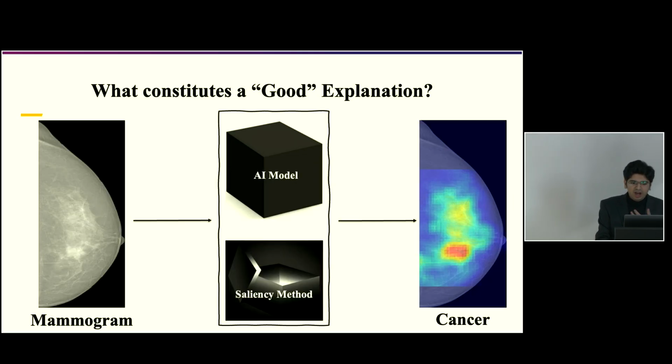So, how do these really work? Essentially, like in our case, we would have a mammogram. We would have an AI algorithm that made a prediction on cancer or not, just a simple binary prediction. And then there will be a saliency method that wraps on top of it, which ingests the medical imaging data and the algorithm, its predictions, to come up with a visualization that helps us understand the relative distribution of feature importance across this entire image through somewhat like a heat map or a saliency map.